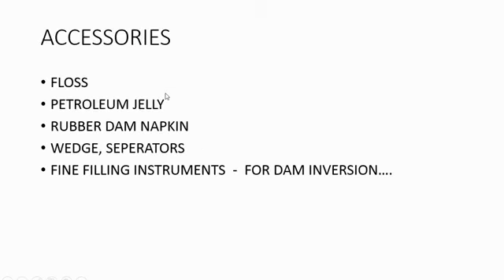एंड यू कैन आल्सो पुट रबर डैम नैपकिंस इन फ्यू पेशेंट जिनमें सलाइवेशन बहुत ज्यादा है और ड्रूल करता है बार बार, और आपको पता है बहुत लंबे प्रोसीजर तक आपको रबर डैम लगाना है, तो यू कैन ऐड अ रबर डैम नैपकिन आल्सो. फ्यू कंपनीज गिव दिस रबर डैम. आई विल शो यू. यू शुड हैव वेजेस, यू शुड हैव सेपरेटर्स स्पेशली ऑर्थो वाले जो राउंड इलास्टिक्स की तरह होते हैं. That will help you a lot in multiple tooth isolation, and fine filling instruments which will be used in dam inversion. I'll be telling you what is dam inversion.